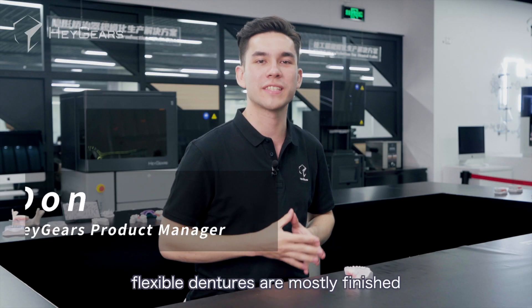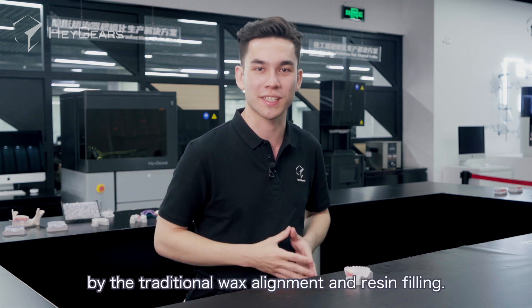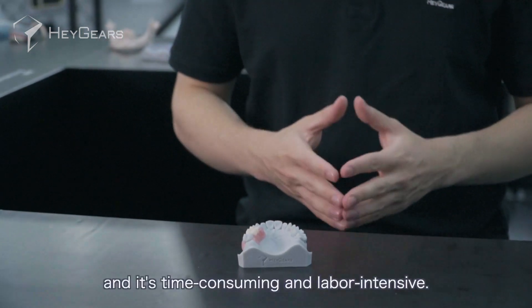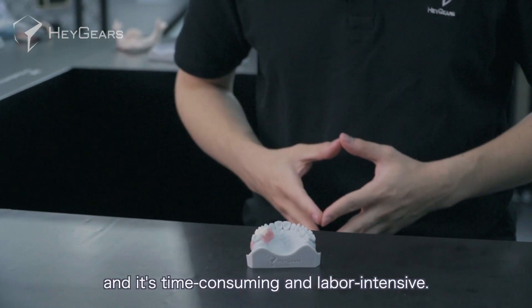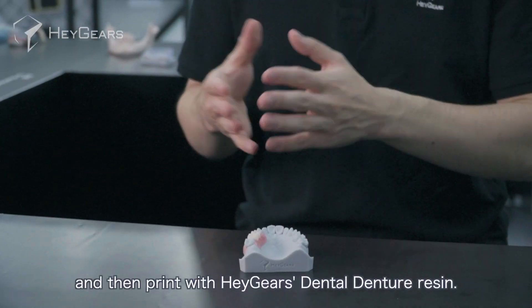At present, flexible dentures are mostly finished by traditional wax alignments and resin fillings. This process involves too many procedures and is time-consuming and labor-intensive. It is now possible to design removable dentures and crowns digitally and then print them.